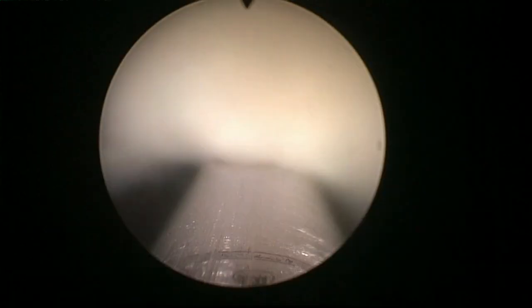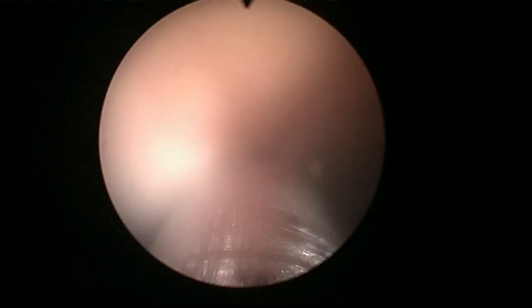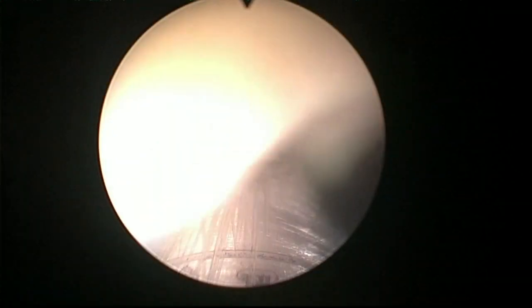So larger prostates take a little bit longer to morcellate, but there's nothing we do differently in patients with larger prostates as compared to the smaller ones. We leave a catheter the same way overnight. We take it out the next morning the same way. We have a protocol to remove the catheter. That's to wash the bladder before removing the catheter, then deflate the balloon and withdraw the catheter a little bit so the tip of the catheter goes in the prostatic fossa, and then wash the fossa to take clots out. Sometimes when we have retention postoperatively, it's because there are clots in the fossa.